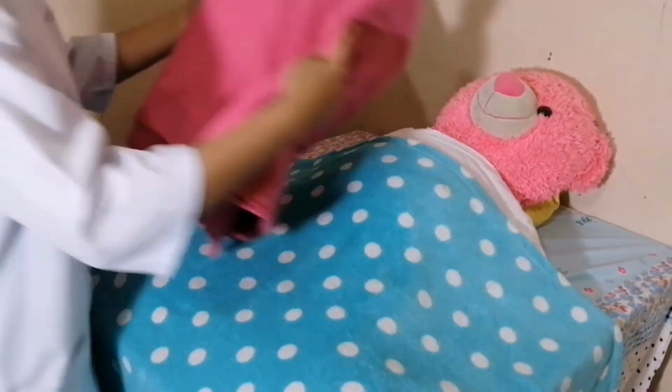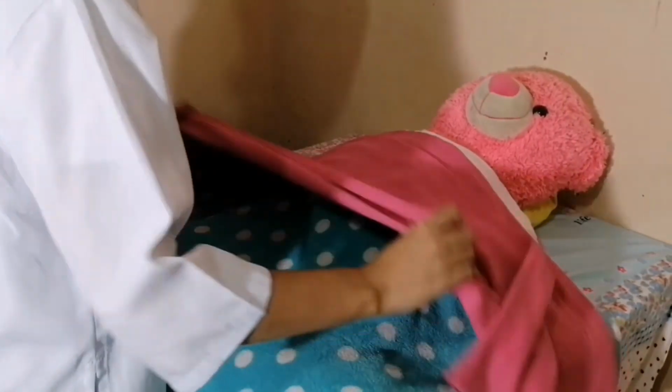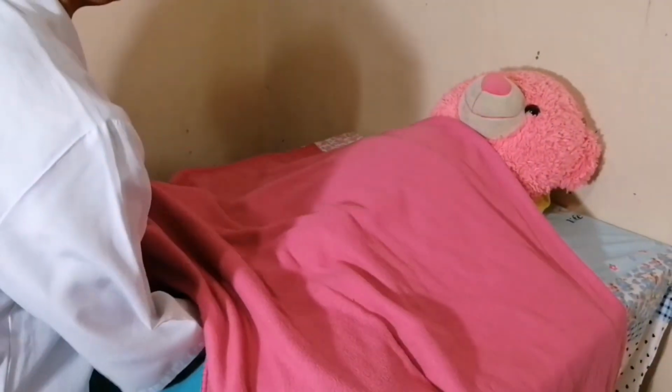So after providing privacy to the client by closing the door and pulling the curtain, the next procedure is to replace the top sheet with a bath blanket and place a waterproof underpad under the client's buttocks.